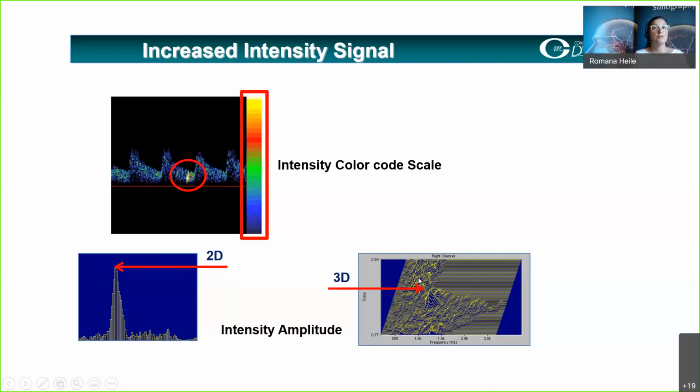I would compare that with the smooth hills of the Black Forest here in my area. And then within these smooth hills, we will face this Mount Everest. So this is the amplitude of the event in comparison to the surrounding blood cells.